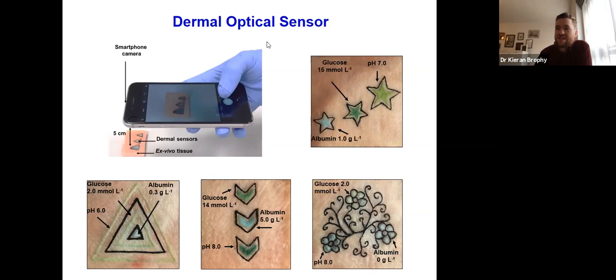First one is, would any of these sensors be well suited to the measurement of stress using sweat perhaps? Or for example, if they're worn as a wearable, such as a fitness band, in training environments?